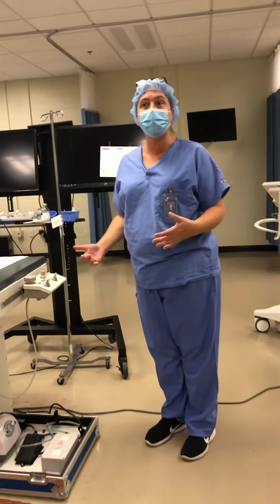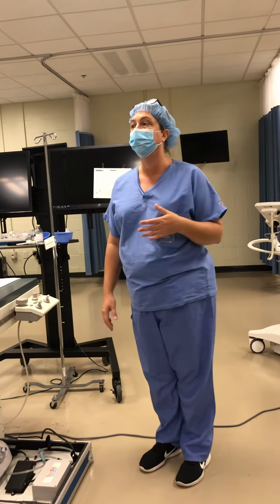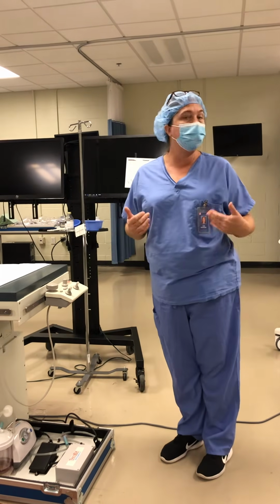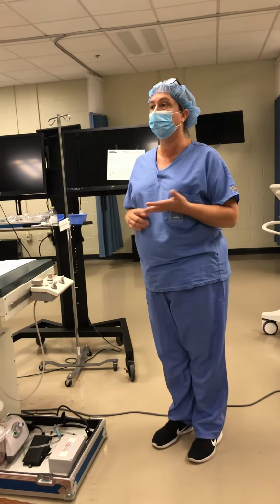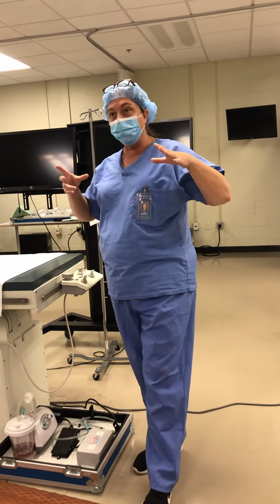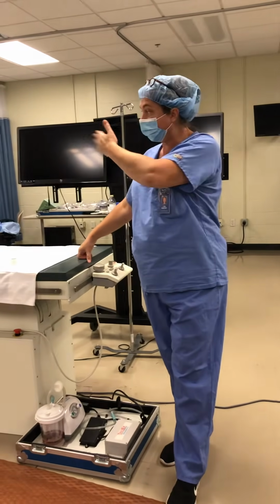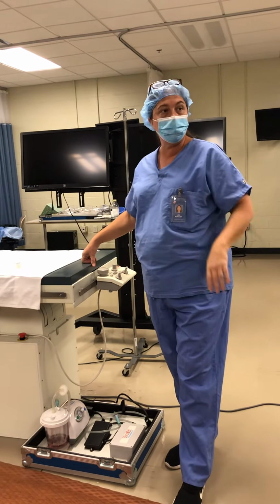And so we'd actually have to inject, run down one, that would be some contrast and some x-ray exposure, and then we'd have to come back up, inject, and run down the other. That would be more contrast and more x-ray exposure. So with that larger image intensifier, they have gotten away from that. So now, being able to swing the C-arm out, we can take those pictures, okay?